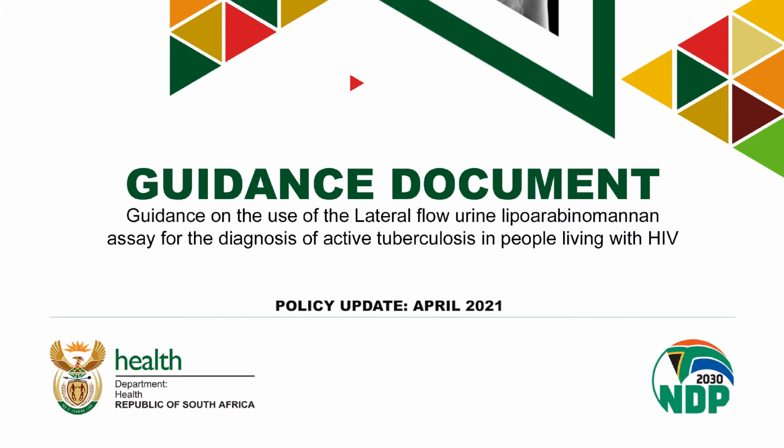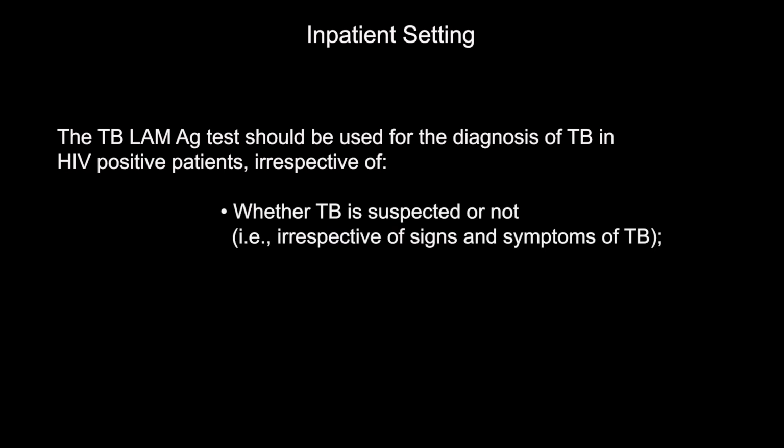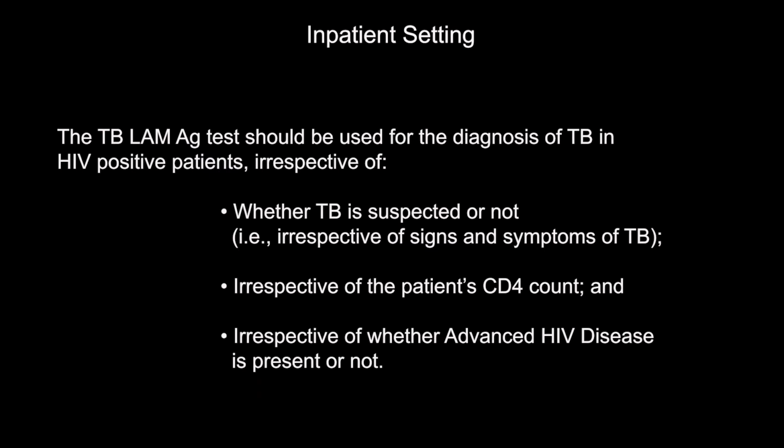The urine TB LAM test can be used in inpatient and outpatient settings. In the inpatient settings, this test can be used irrespective of whether the patient has TB symptoms or not, irrespective of the CD4 count, and irrespective of whether the patient has advanced HIV disease.